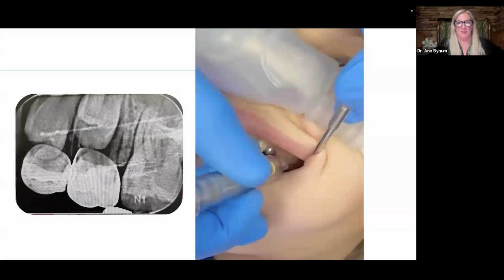So this was just today. This was Dr. Nash in our office. He did this today. Kid had an abscess. He's going to take out I and J on this patient. And you can see there's a good chunk of bone between J and 14 right there. So studying your x-rays is very critical. We're no longer just studying them for decay and disease. We really have to look at bone quality and content.